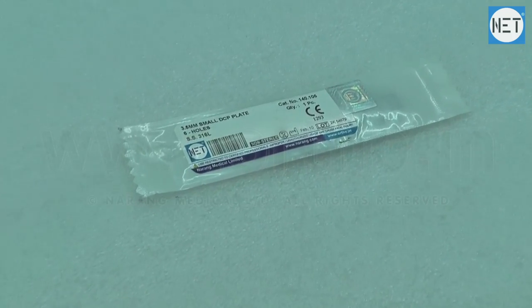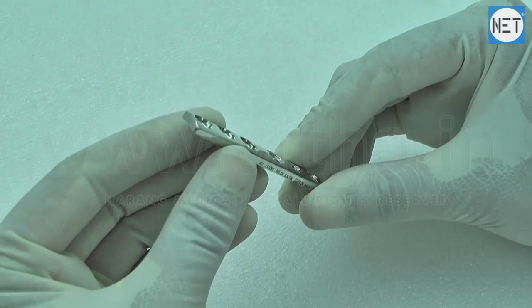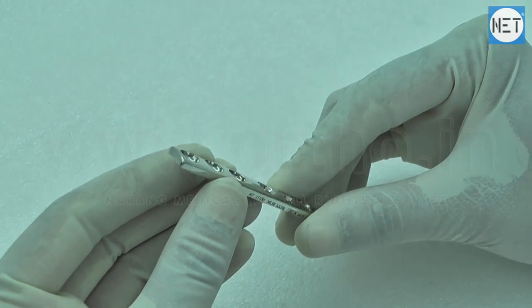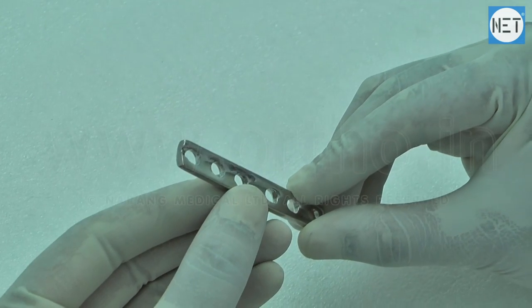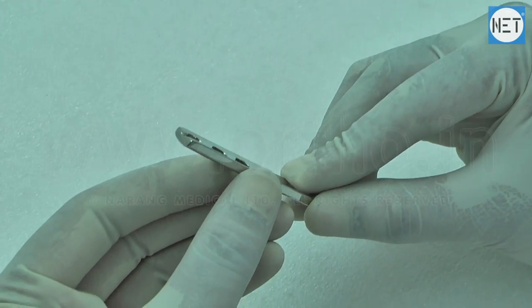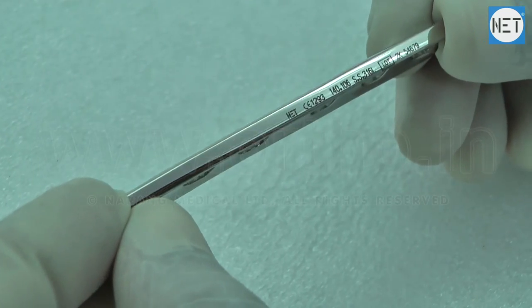Net Brand Dynamic Compression Plate for 3.5 mm screws. These plates are indicated for fixation of fractures and non-unions of clavicle, scapula, olecranon, humerus, radius, ulna, pelvis, distal tibia, and fibula.